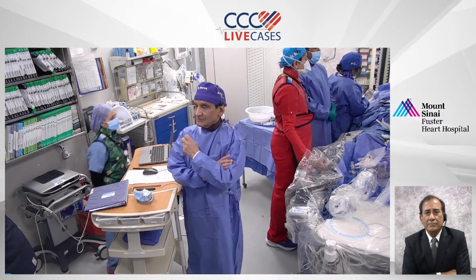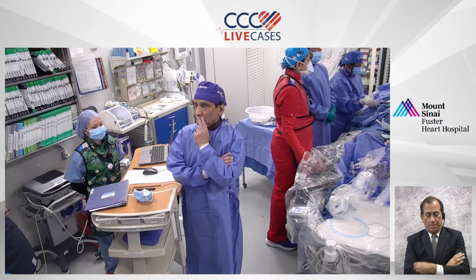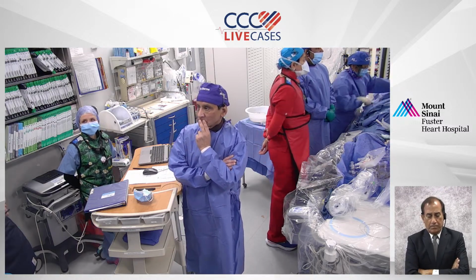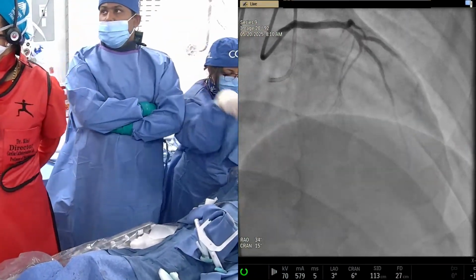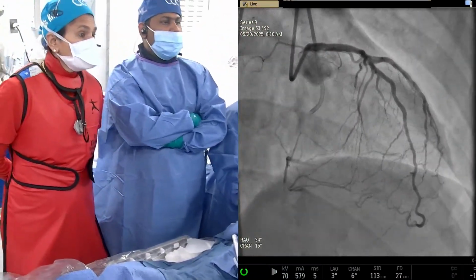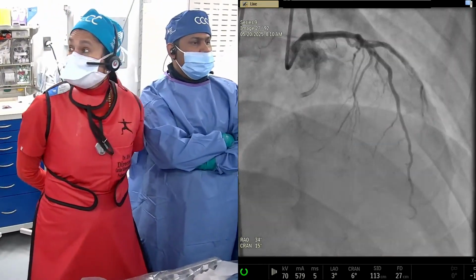Yeah. So let's go back to this. So I think this was a picture, right? Here, this is where I think we started when we said which septal. This is the angiogram now. You can see that, right? The large septal that is fanning, and then you see.